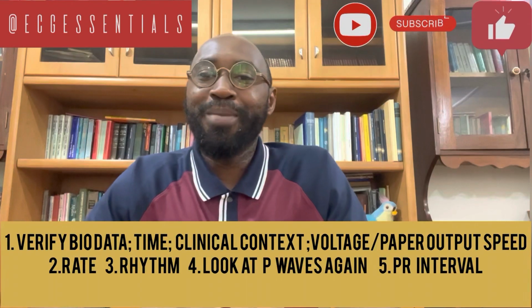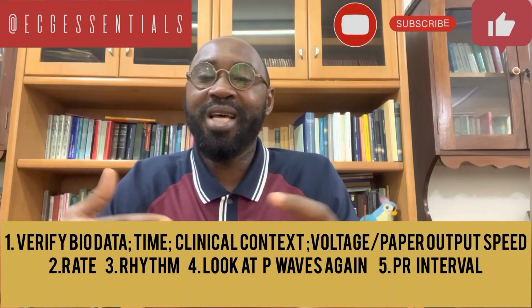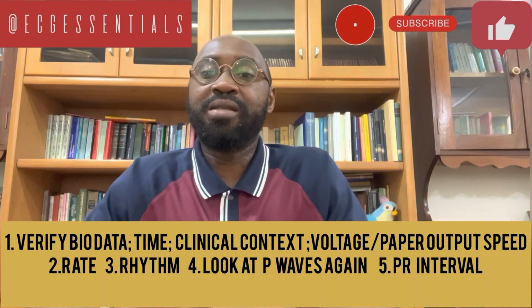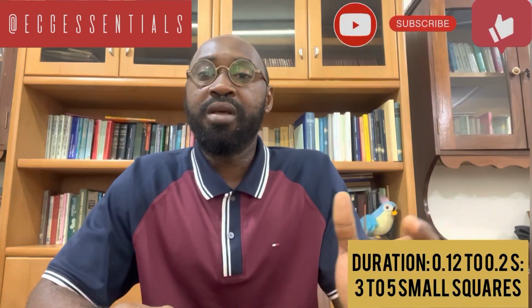Having appreciated your P wave, we are now moving to the PR interval. The PR interval of course has within it the PR segment. It is the period from the start of atrial depolarization to the start of ventricular depolarization, and that duration is usually between 0.12 to 0.2 seconds.